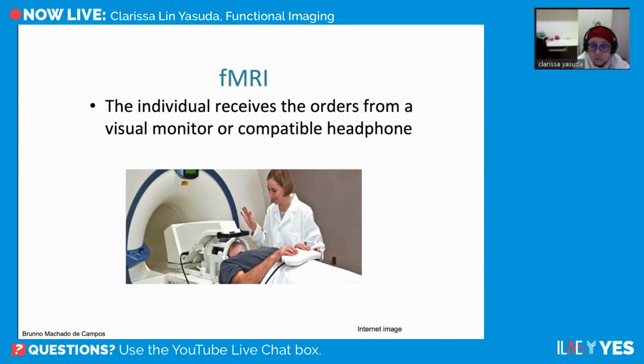For those who are not used to fMRI, you basically have the individual in the scanner. All this setup is built so you can have the visual stimuli here, and also headphones that are compatible with the machine, and you can also have a joystick or other tool that allows you to give an answer to the stimuli you are receiving on the monitor. Okay, so this is just the basics.